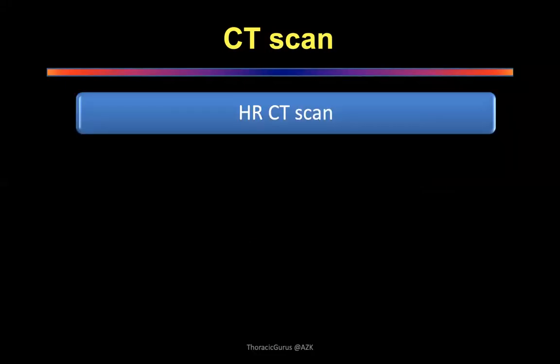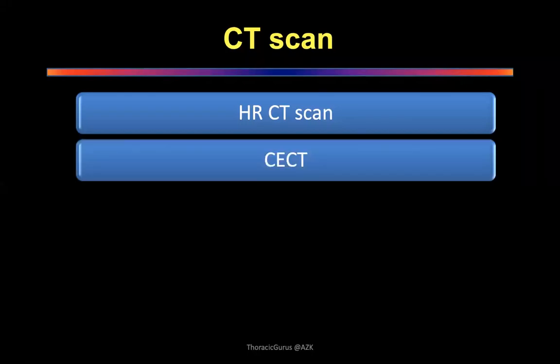What are the different types of CTs available in the market? So you have the HRCT, which is high resolution CT. This is predominantly used to look at lung pathologies or interstitial lung diseases. The protocol for taking the CT is designed to move onto the right side of those Hounsfield units that I showed you. So this is a special type of CT which moves the whole capture to the right side of the Hounsfield units. Hence, the lung is better delineated in this.